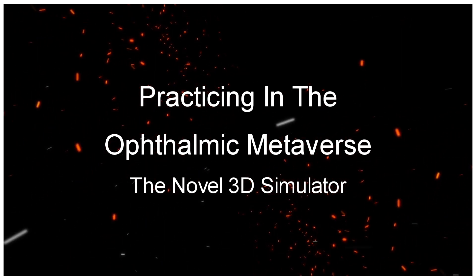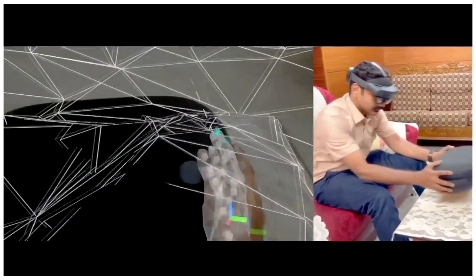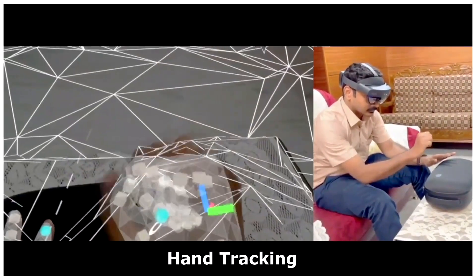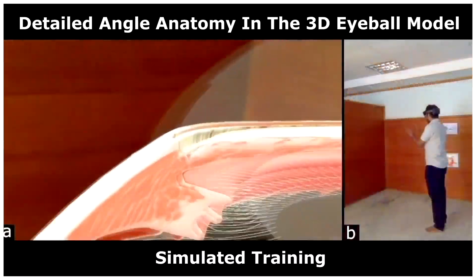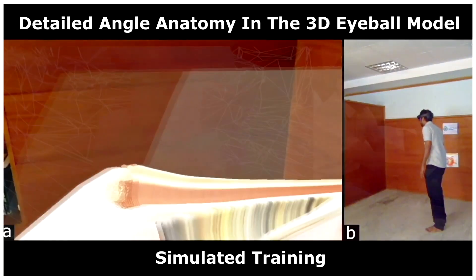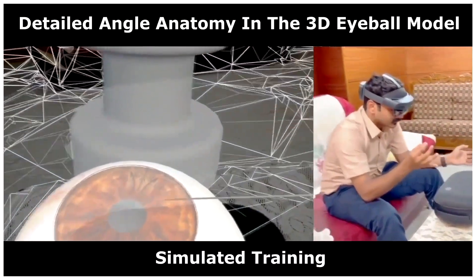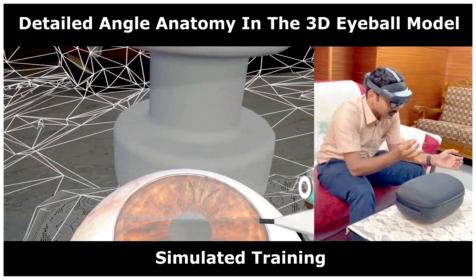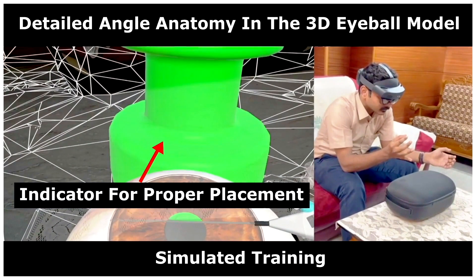Practicing in the ophthalmic metaverse: the novel 3D simulator. With the use of hand tracking in the HoloLens, a simulated training module can be created. The 3D eyeball model gives a real-time simulation of the angle structures to practice the implantation of the iStent. During simulated training, on proper implantation of the iStent in the trabecular meshwork, the indicator lights up as green, improving the agility of the doctor for iStent implantation in the angle.